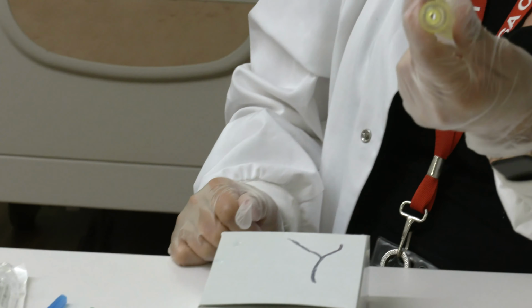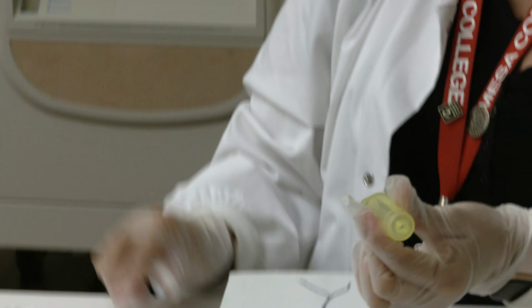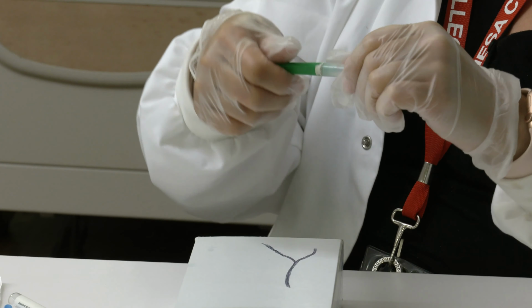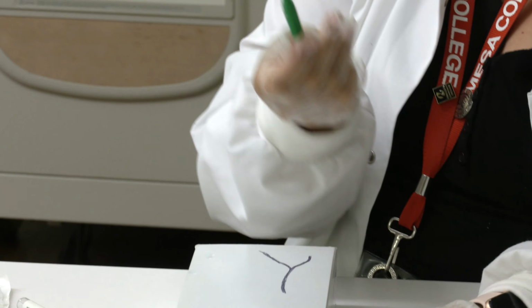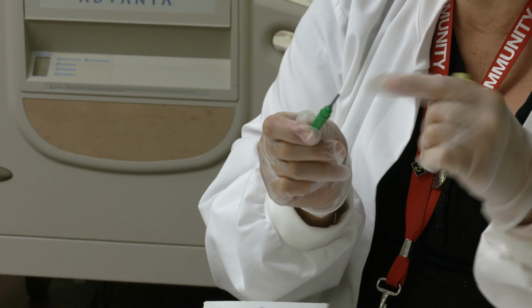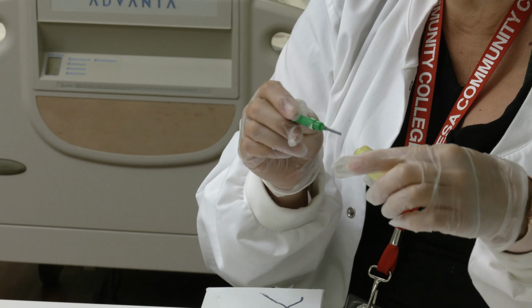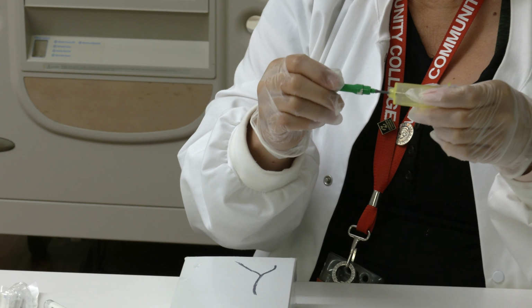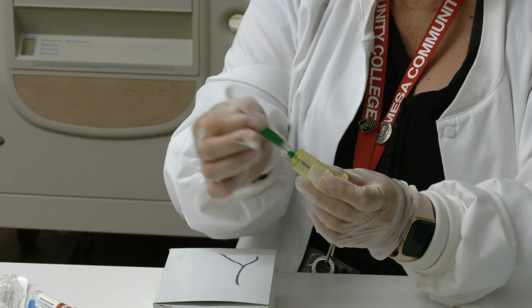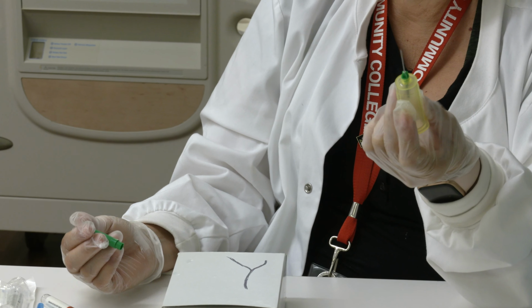So we're going to start with the vacutainer. We're going to have our lab tube, and then you're going to have a specific vacutainer needle. And you're going to see this little rubber part. Don't get all excited and touch it because there's a needle underneath it. But it's going to go into your vacutainer. And then when I release this piece, there's going to be a needle here.